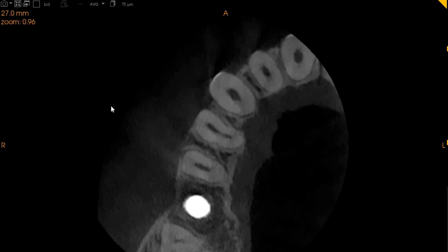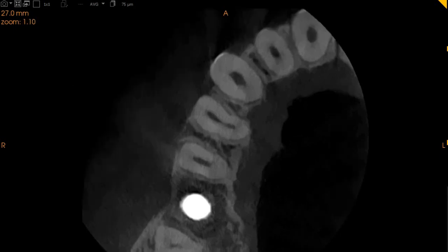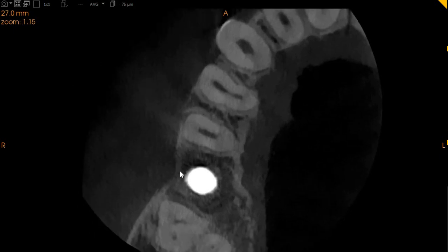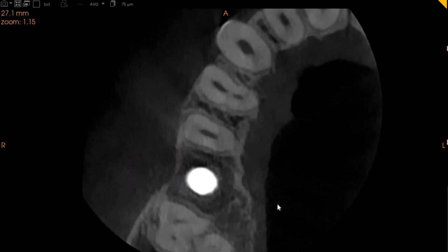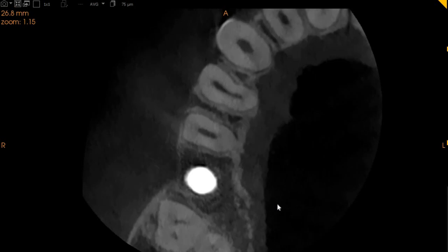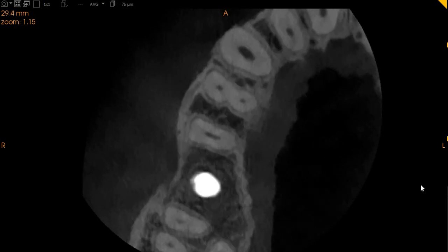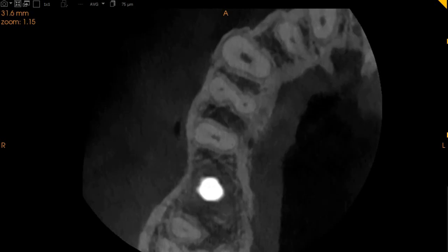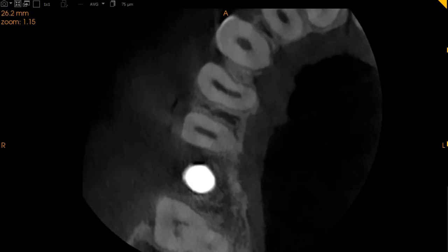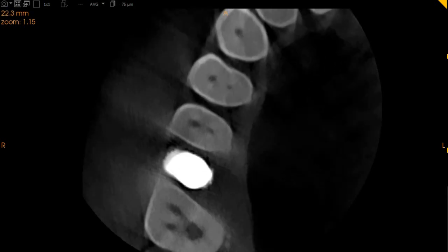This is the axial view, or basically the top-to-bottom view. Here you can very clearly see that we have this area and this area of slight bone loss in the buccal, but the palatal seems absolutely fine — no bone loss on the palatal aspect. Good bone support around the entire implant; no peri-implantitis can be observed.